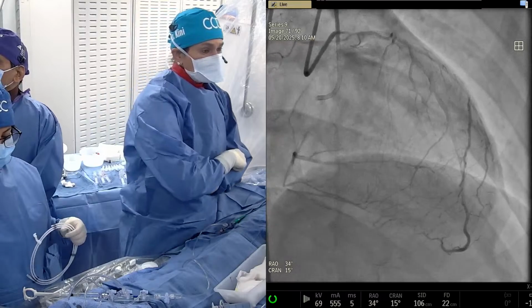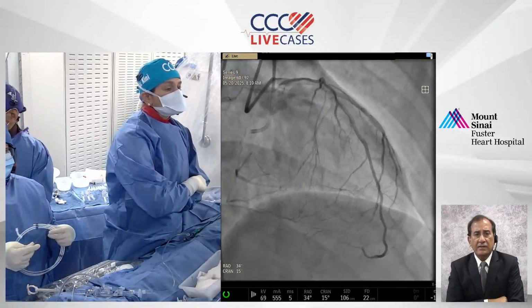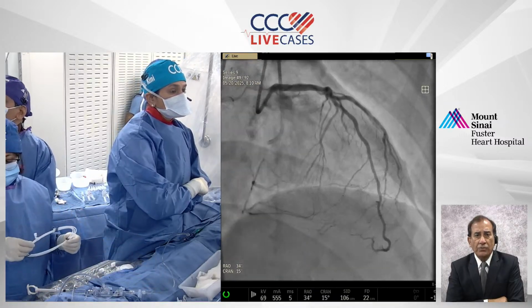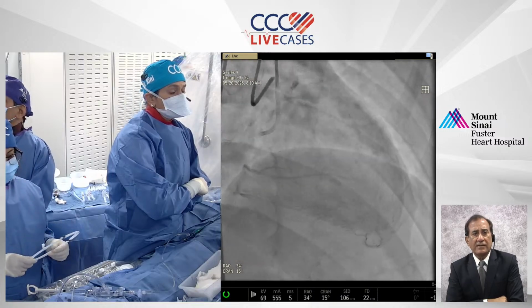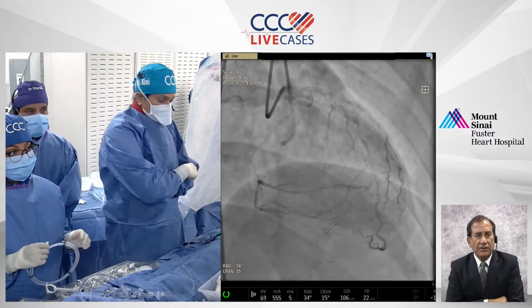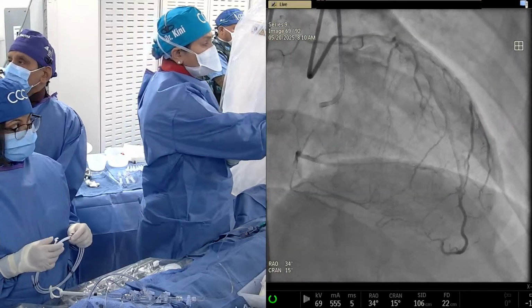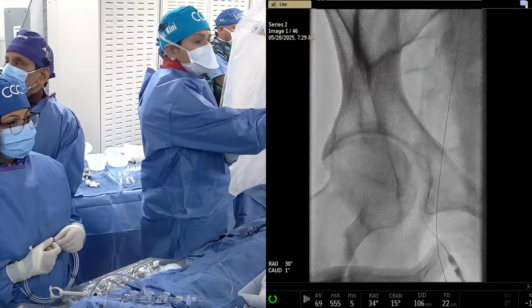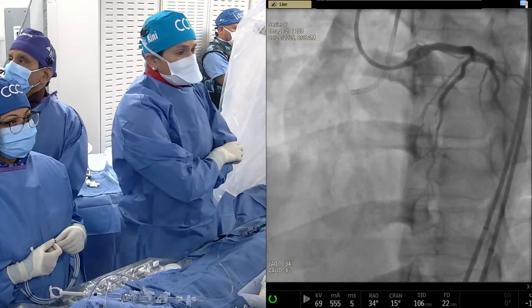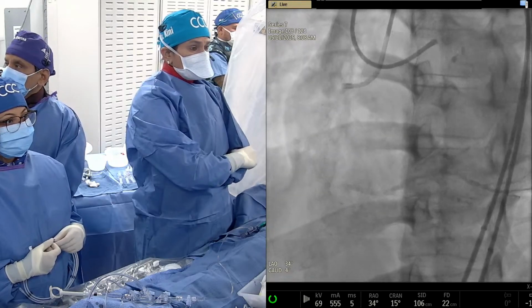I'm modifying a question which came in, about a patient like this attempted at another institution. Would you still give it an antegrade approach possibility or proceed straight to a retrograde? I think the previous intervention was done within 4 weeks, and I did see the angiogram. So there were multiple channels created. Though, if you see here, it does not look that way. So the question is, what do you think?